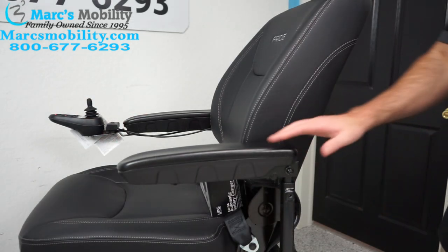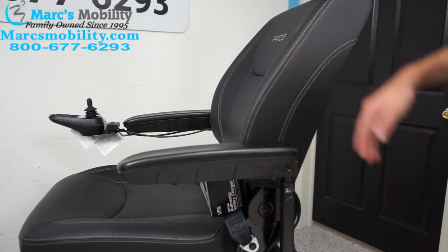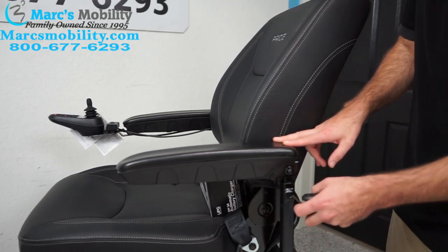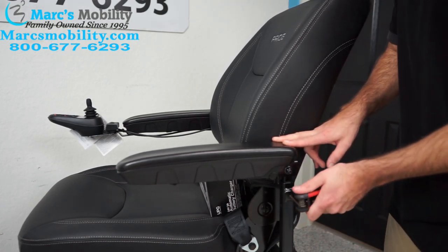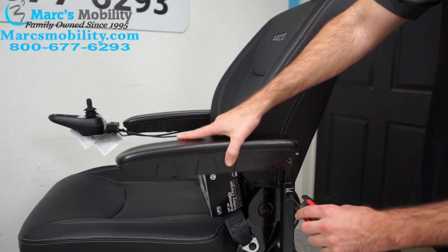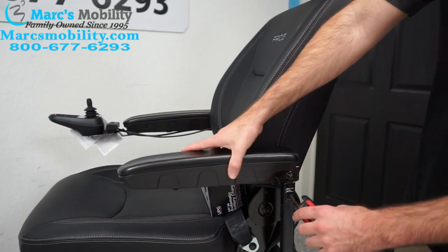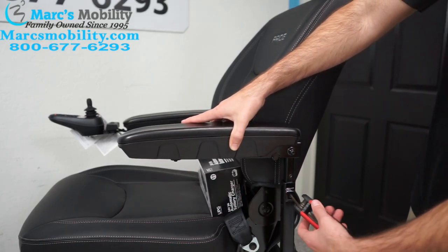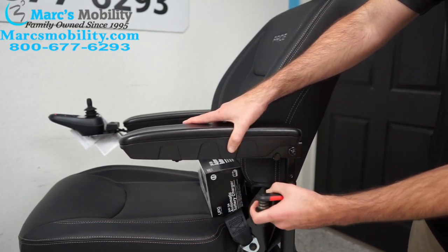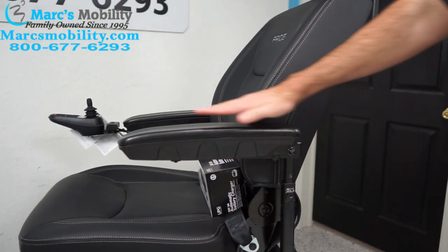The next adjustment we're going to do is how to bring the arm up. On the Air 2 arm, there's a little set screw right here, and we're going to use an Allen wrench. You want to loosen that screw, and now the arm can slide up or down — whichever position you want. Hold it there, and then tighten the screw again. Now the arm is sitting higher.